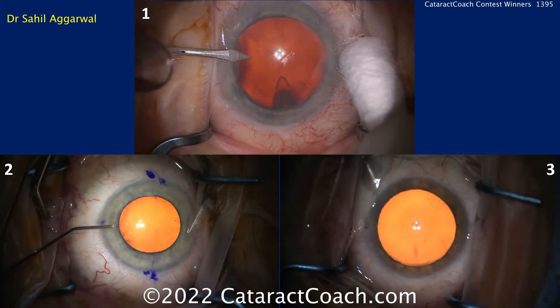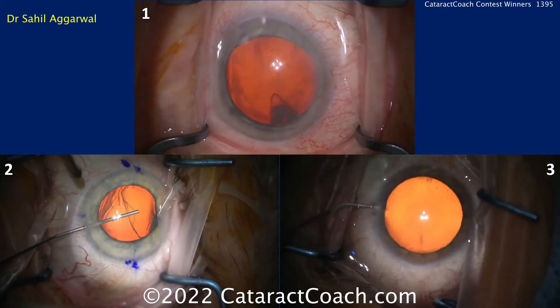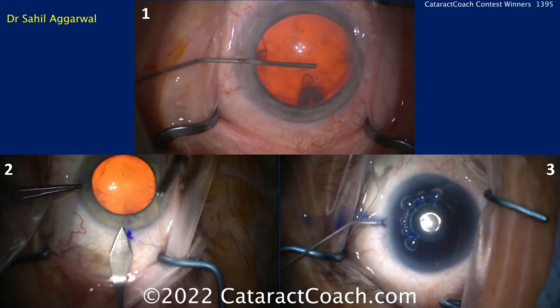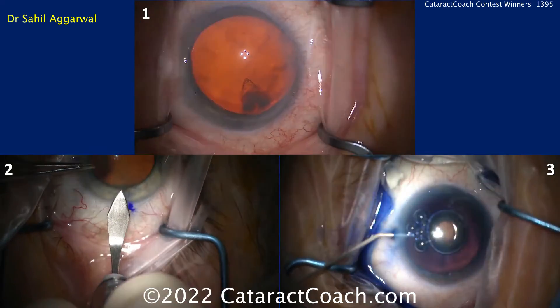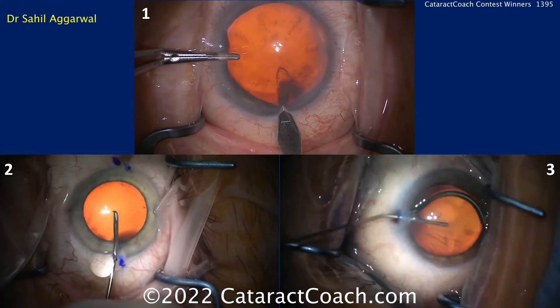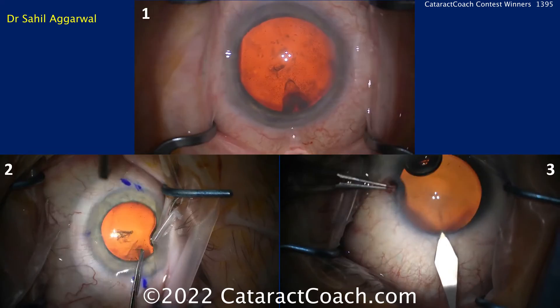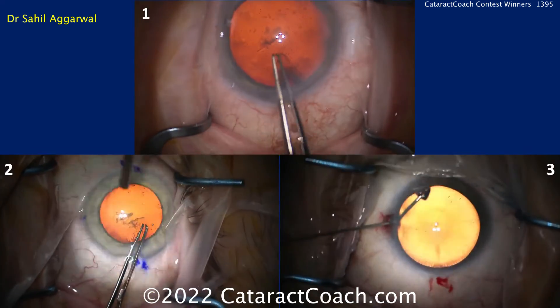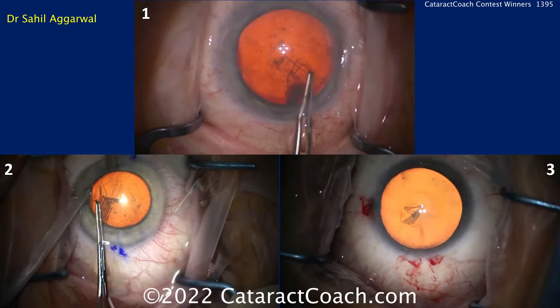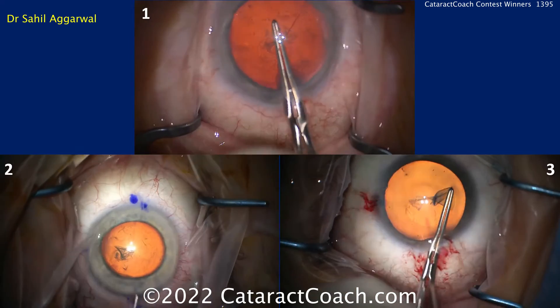Guess the case order. My name is Sahil Agarwal. I'm a second-year resident at Duke, and I wanted to give you a sample of three cases out of my first 60 completed at Duke. You can see in panel two that I made a little bit of an anterior incision using TriPan; in case three, I left a little bit of an air bubble in the anterior chamber and the incision is a little bit posterior. In panel one, I started using a marked instrument to help me create a 5.5 millimeter rhexis.